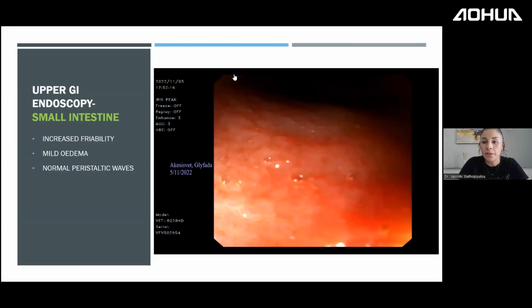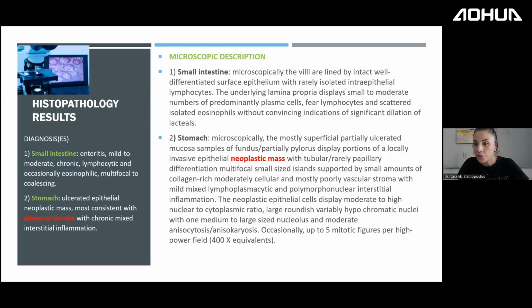The samples that I'm taking, both from the stomach and the intestine, are between 8 and 12. Is there any clinical usage in taking samples from the other parts of the stomach as well? Definitely. You will always take samples from each part of the stomach and from the intestine. Because what if there was another ulceration, for example in the duodenum, and I would lose it if I wouldn't go in, or any other underlying pathology? You do not diagnose macroscopically, you only diagnose microscopically.